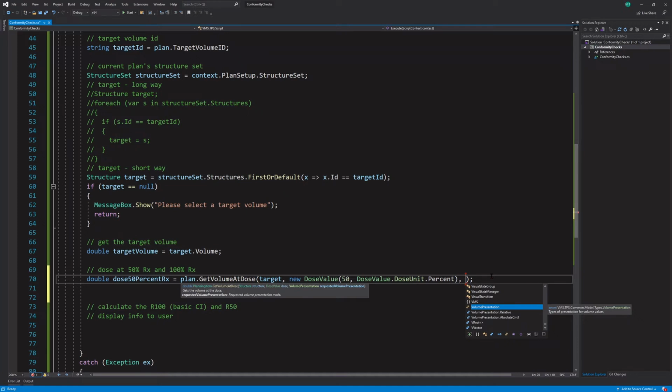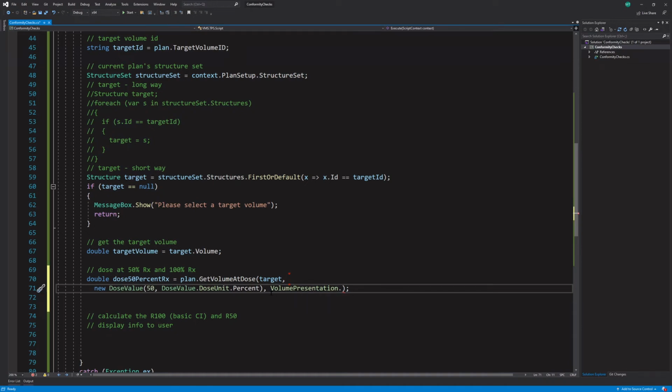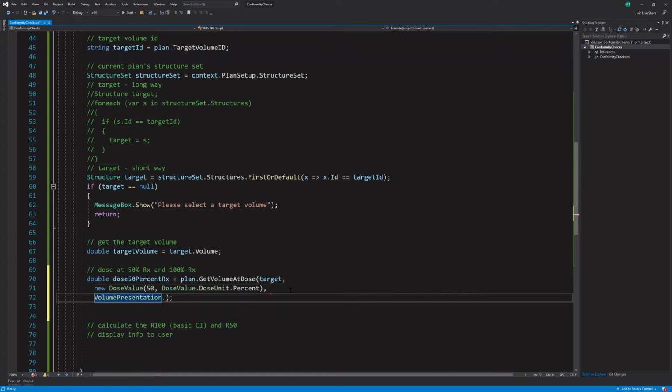Oh, and it needs a volume presentation. So we'll say volume presentation. So the IntelliSense gave it to me. And then since we're running off of the lines, this is a nice thing that you can do, is you can go down to each line after the comma. Okay, so we need a volume presentation.